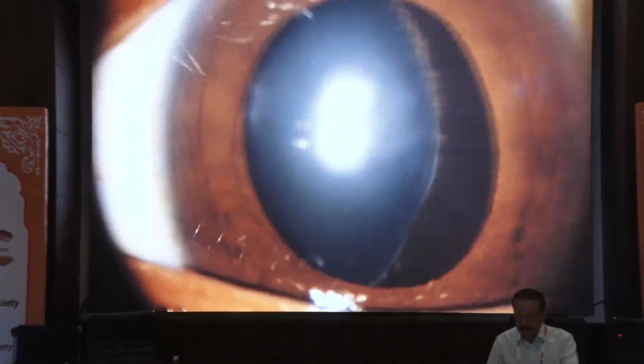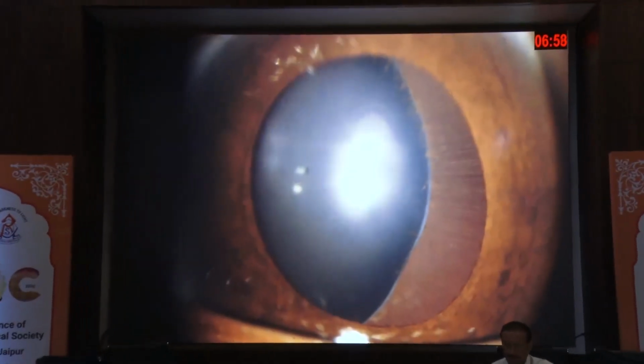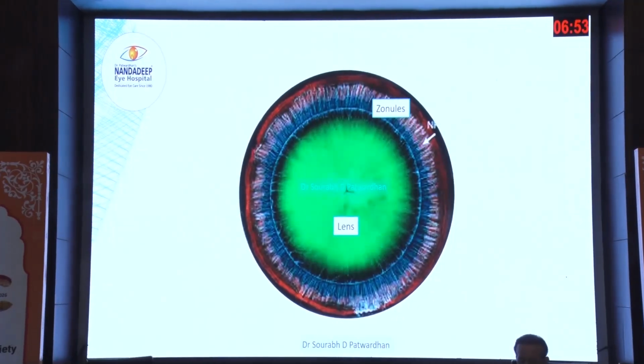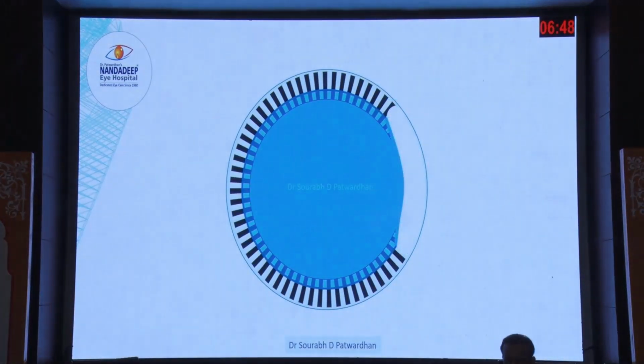Good morning everyone, and thanks a lot Dr. Satanshu Mathur sir for inviting me in this particular IC, and I'll be speaking about subluxated cataract or zonular dialysis cases. All of us who are dealing with cataracts, when we see a case like this, it's sometimes mouth watering. It's just like someone who is a hiker or climber. They look at Mount Everest and they say that I want to climb it once. Similarly, subluxated cataract is like a last resort, like the last challenge we want to conquer. So let's go through the thought process of how to conquer it.